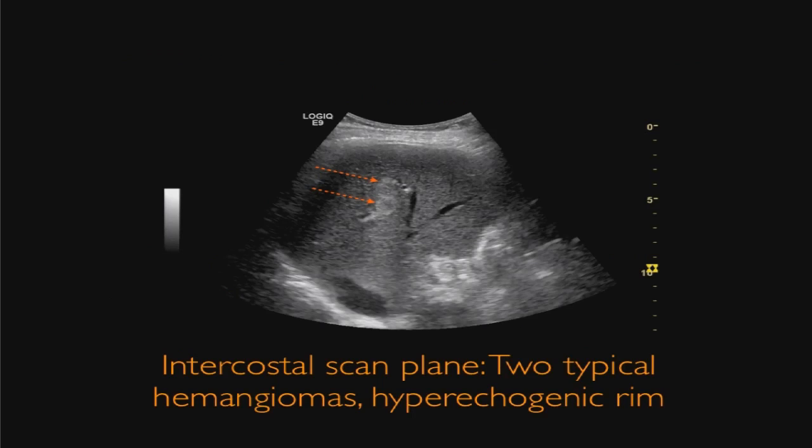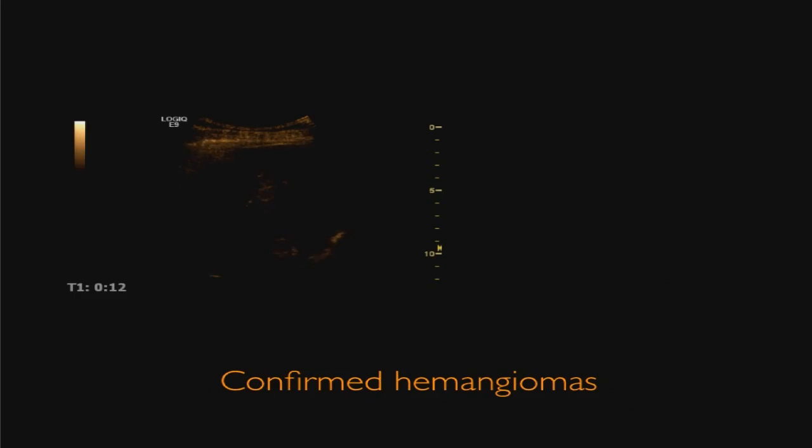And of course there are very typical findings, as you know also from other imaging modalities. Here you can see two neighboring hemangiomas, and you see what is typical on grayscale: we have this echogenic rim around this lesion. And when we look at it with contrast, you can see that hemangiomas are supplied by arteries, of course. So we have the first bubbles coming up during the arterial phase when the portal veins are not filled. This shunting is also this arterial filling, these cotton wool signs, as it was named in former days. This is causing this hyperechoic rim around these hemangiomas.